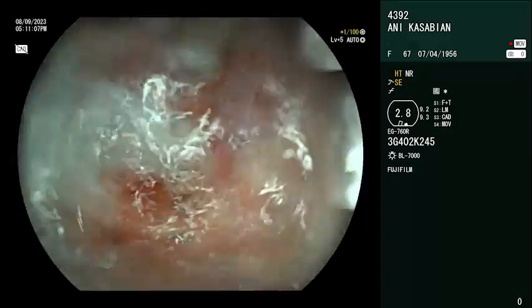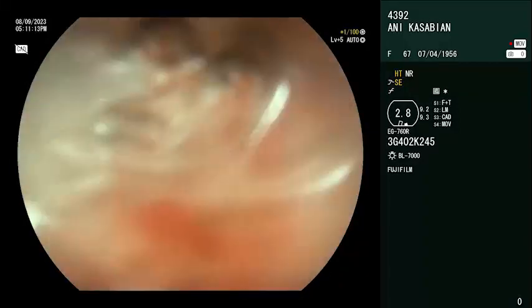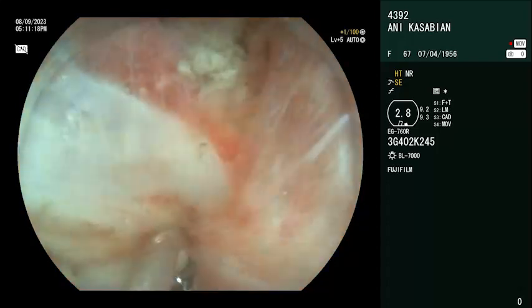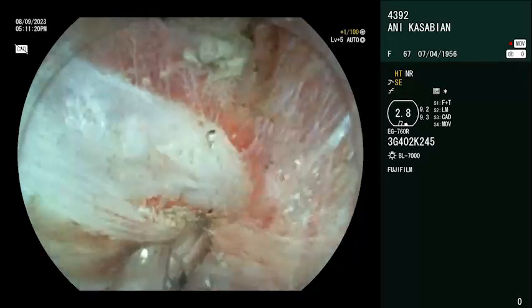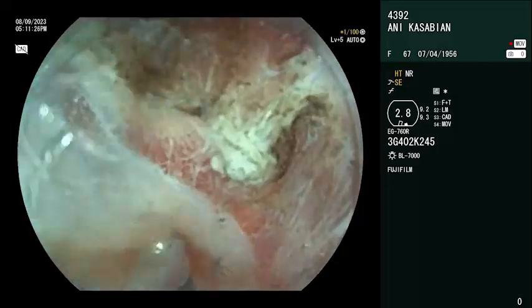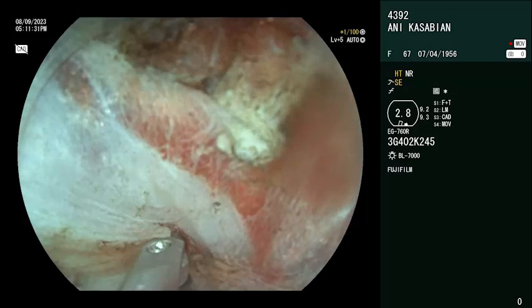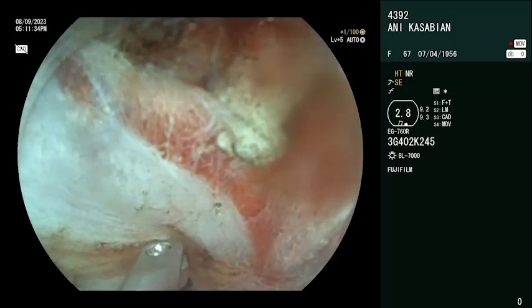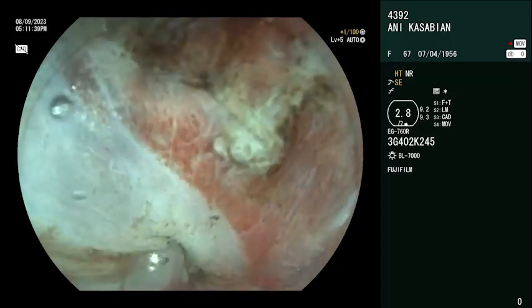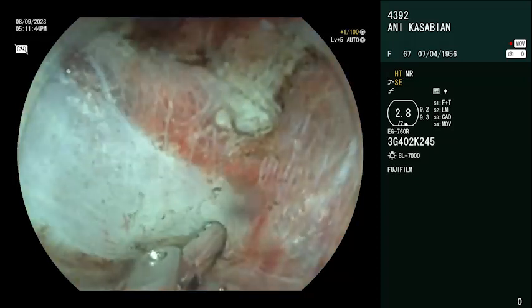Just above the muscle and intermuscular, if you can. It's a new way, the intermuscular technique. It works very well. We can see the vessel just in front. Open. Close. Excellent. You see, it stopped the bleeding. I am in soft coagulation, and apply the current. Okay, open. Perfect.